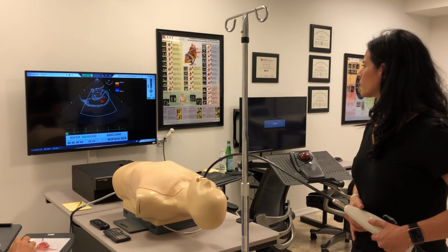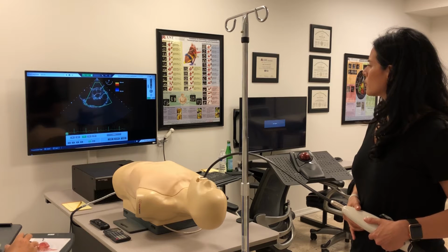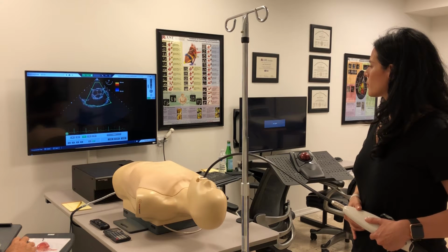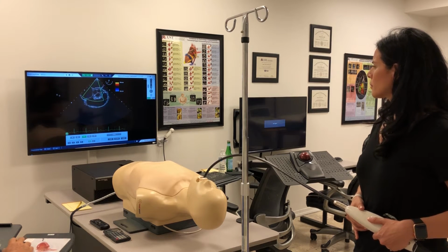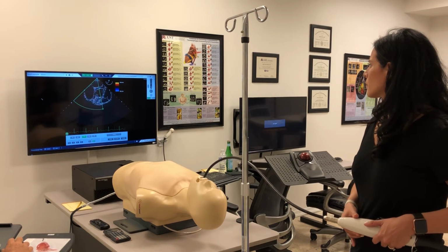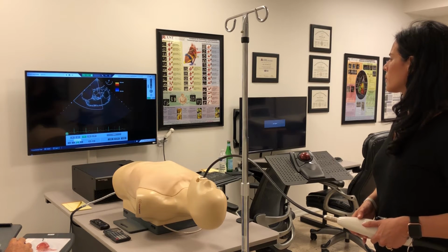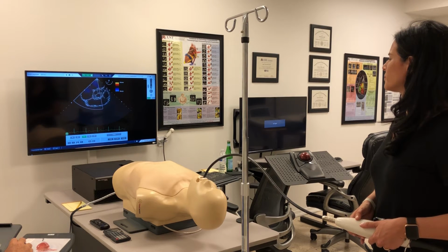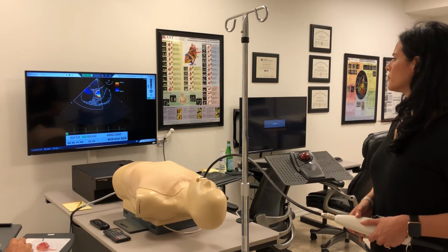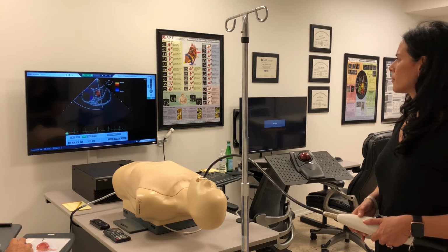And while you're here, you should remember not only to color the aortic valve to look for regurge or stenosis, but also bring your color box up to the interatrial septum looking for PFOs and ASDs. Now when you do that, you should drop your color scale down to 20 to 30 per the American Society recommendations. Here we see blue on either side of the interatrial septum, but there's no color transgressing the septum.